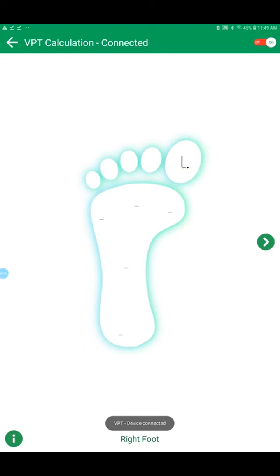Now let's assume the patient has a wound or the right toe is amputated. The software may not know it. In that case, we make the value 0 in the Biothesiometer, and then I record it. So the 0 is recorded. Then I increase the value and test it. At a particular value, the patient gets a vibration. Then that value I start recording.